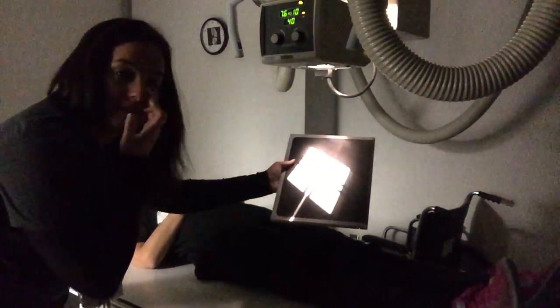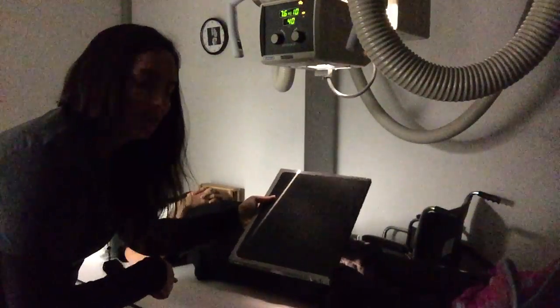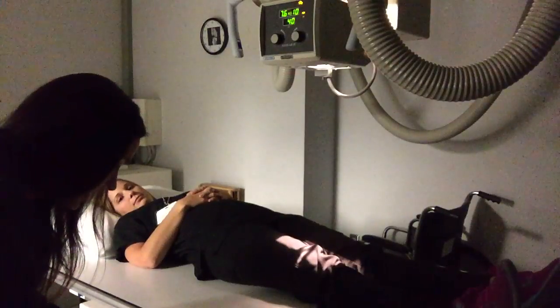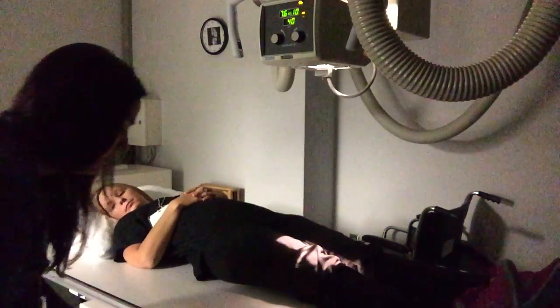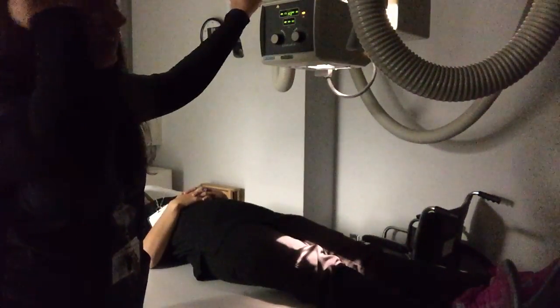And once again, as we recently learned, your little orange line, red line here is going to be at the bottom. So I'm going to put that into the bucky, and I am going to make sure it is centered here before I lock it into place. And I'm going to line my bucky up to my light, which I have already done. And I'm going to make sure I am at 40 inches SID.